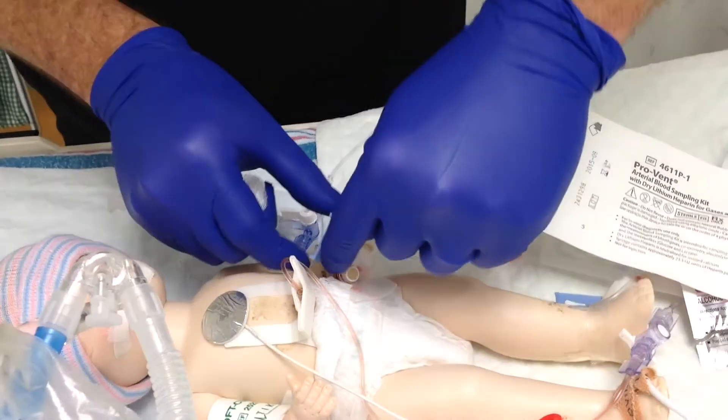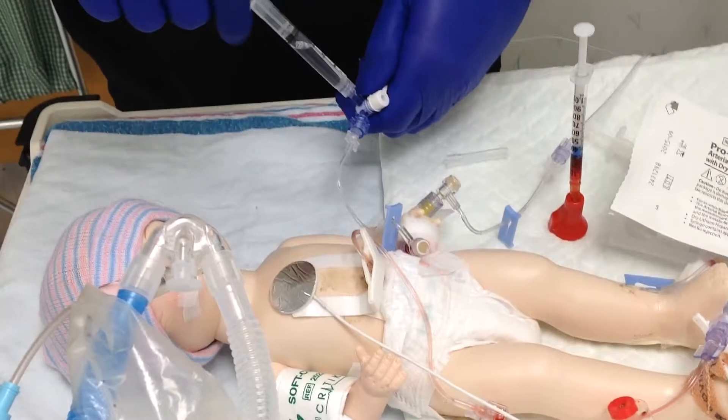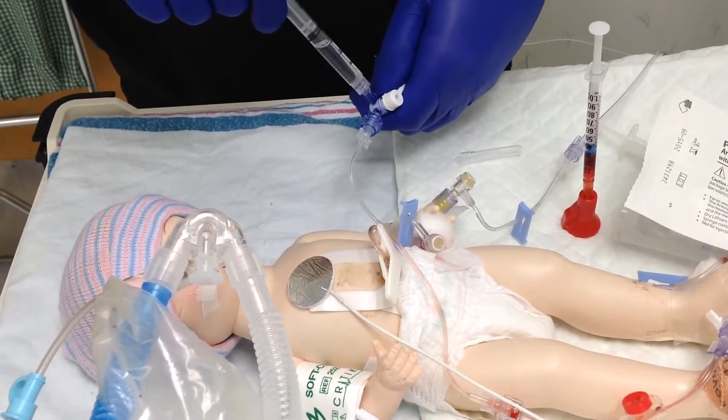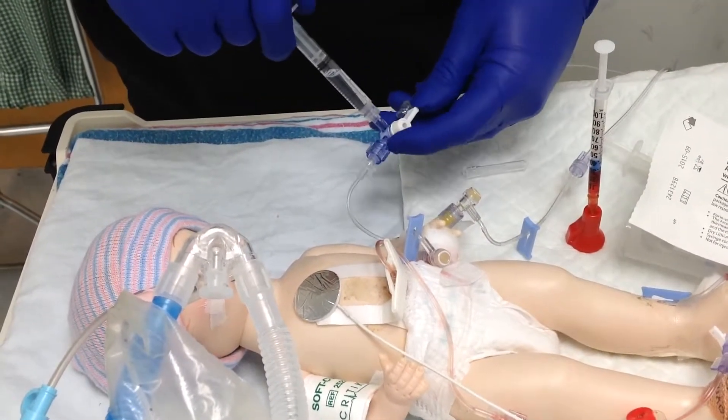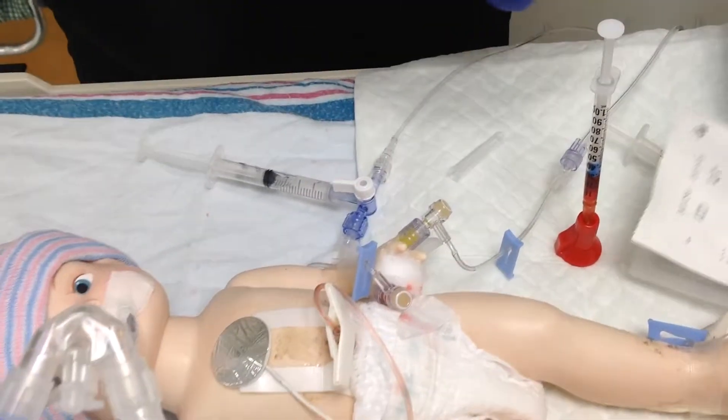Make sure you un-clamp the clamp — that's very important. You're going to open your syringe and pulsate some flush through that line. Turn it back up. Look at the monitor and make sure your waveform came back.